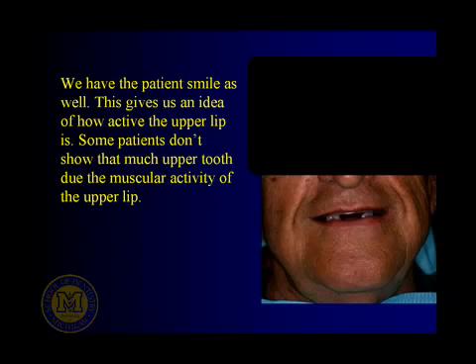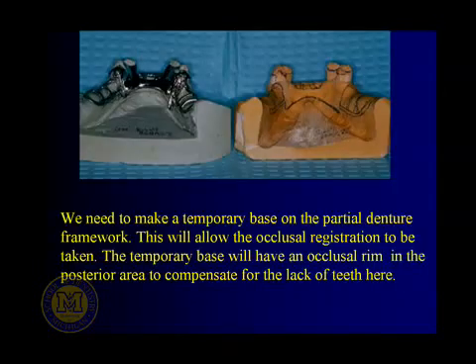Now, Dr. Jan and I, he's up in the 3 Blue Clinic, I love to get his goat every time I can on this. Some faculty feel that you need to put, well, you do need to put temporary bases on the back of your partial denture framework and some sort of an occlusal rim in order to take jaw relationship records, to get a bite.